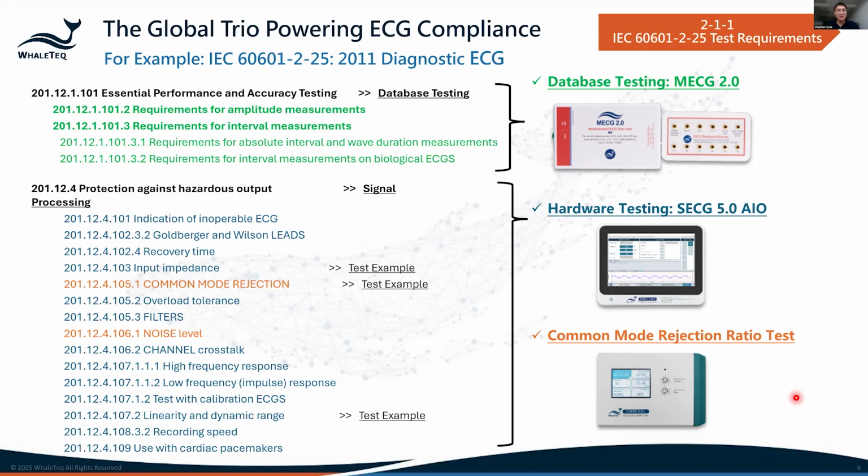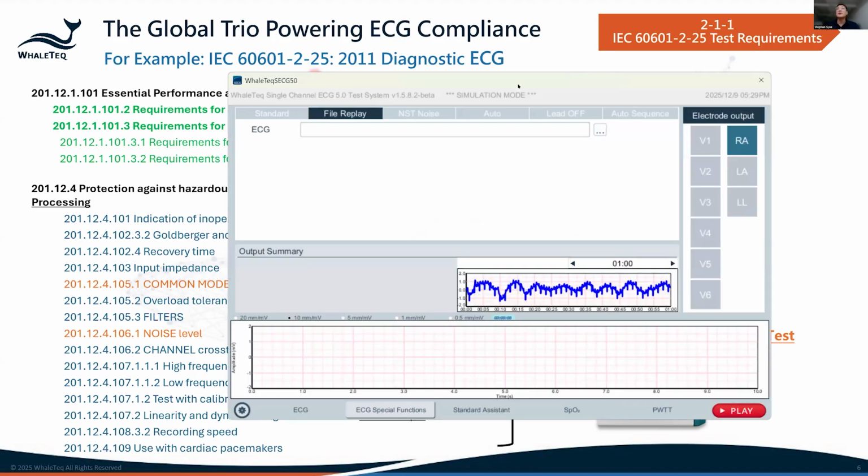Hi, Robert. Can we simulate ECG and SpO2 simultaneously? I mean, both ECG signal and SpO2 are coming from the same person. The answer is yes. So once again, you are talking about the same person, so there will be two answers.